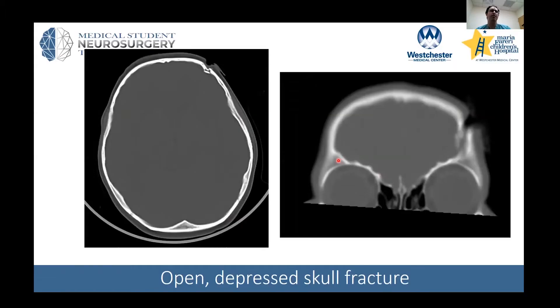Staying with the theme of trauma, this is an example of a skull fracture. We're looking at bone windows — we can see that the nice linear structure is interfered with in this area and it's depressed. This was a young boy, about five years old, who was skateboarding without a helmet and fell, striking his head.